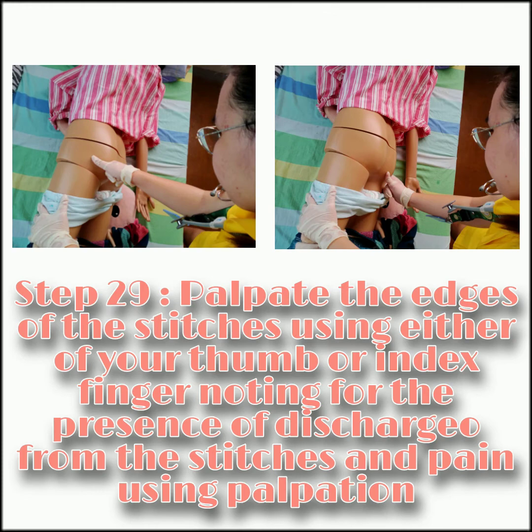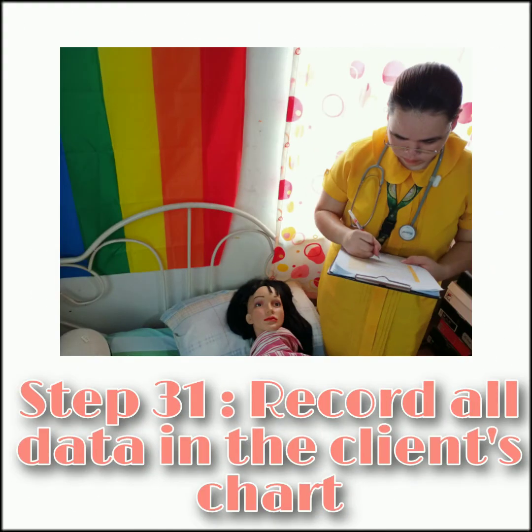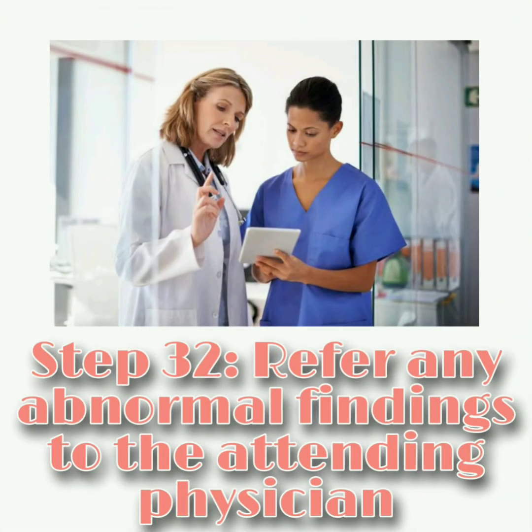Step 29. Palpate the edges of stitches using either your thumb or index finger, noting for the presence of discharge from the stitches and pain upon palpation. Step 30. Remove gloves, dispose or arrange used materials properly. Step 31. Record all data in the client's chart. Step 32. Refer any abnormal findings to the attending physician.